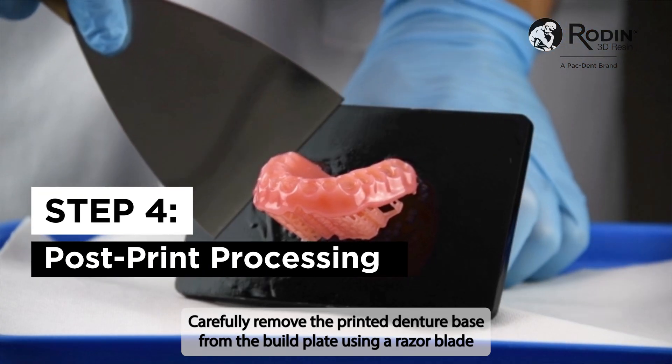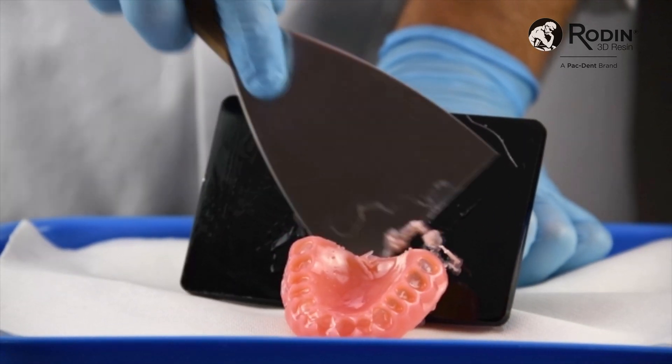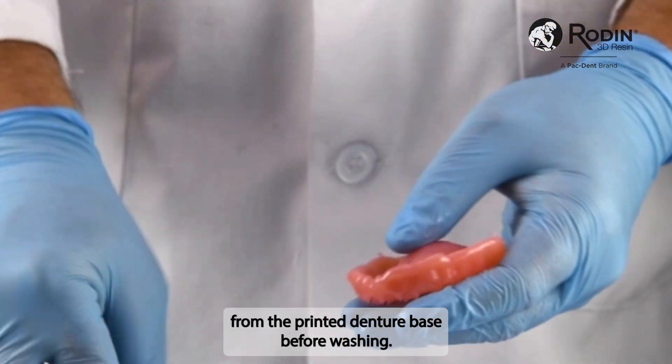Carefully remove the printed denture base from the build plate using a razor blade or clippers. Manually remove the supports from the printed denture base before washing.